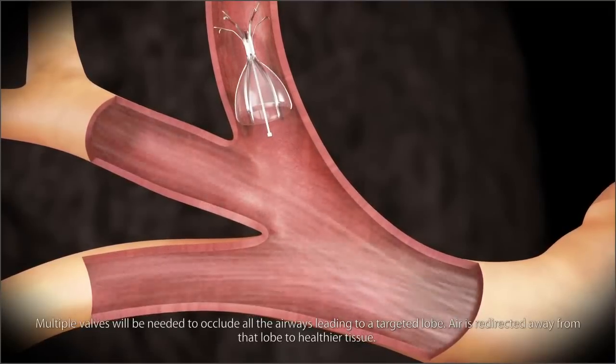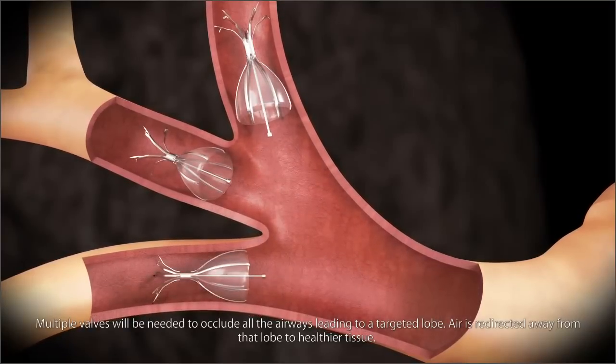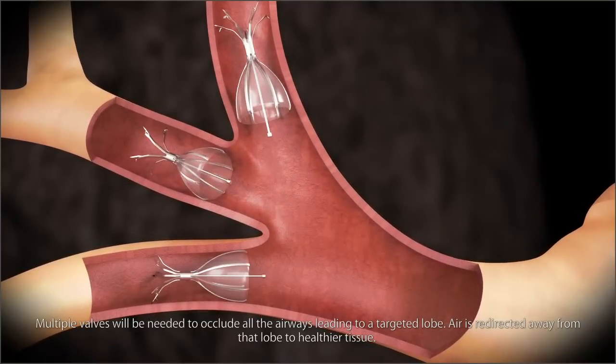Multiple valves will be needed to occlude all the airways leading to a targeted lobe. Air is redirected away from that lobe to healthier tissue.